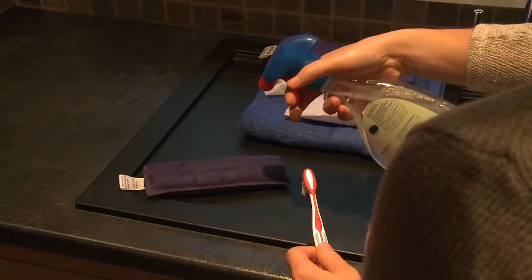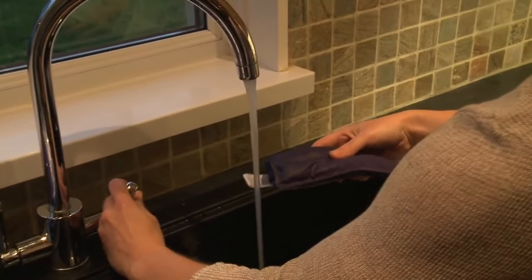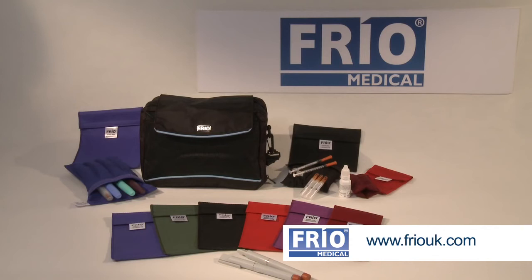Or, for a more thorough clean, use a brush such as a soft toothbrush or small nail brush, ensuring it has soft bristles. Rinse the wallet under running water without damaging the crystals inside. The outer cover can be washed in a mild detergent. You can clean the wallet when it's dry or after it's been activated. For more information, visit the Frio website at www.friouk.com.